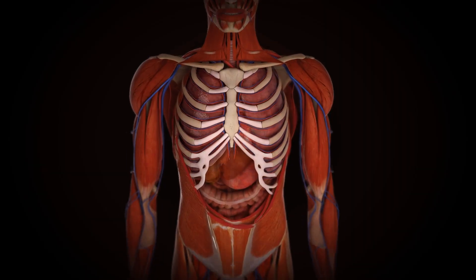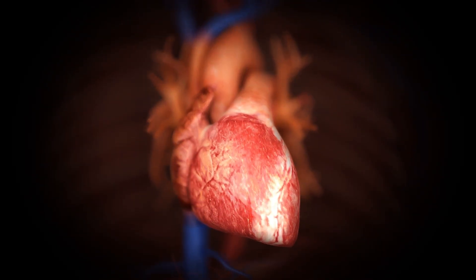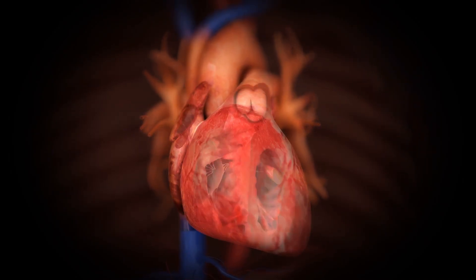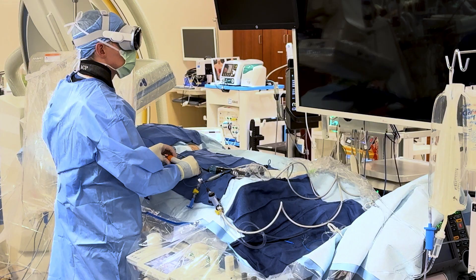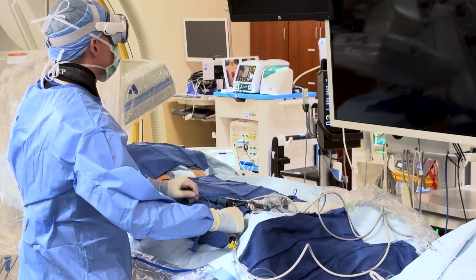What if we could take the three-dimensional model and place it on the patient where the heart actually is — moving the tool would be much more intuitive. What if we're doing a new procedure that hasn't been done before at Stanford? Someone could proctor remotely and see that three-dimensional model. It's a perfect space to flex this technology. The procedures are all minimally invasive, and the ones where we used this went great — great outcomes, patients did great.